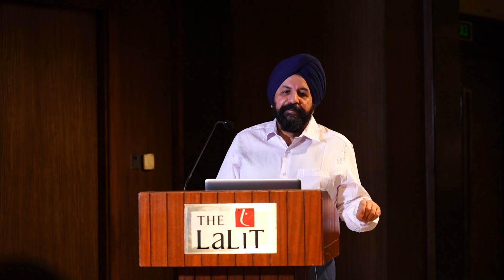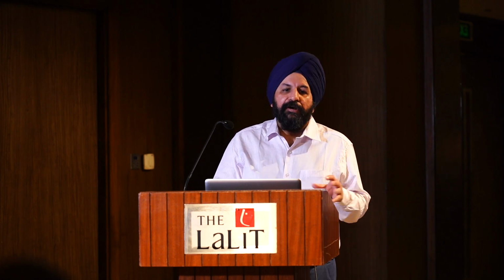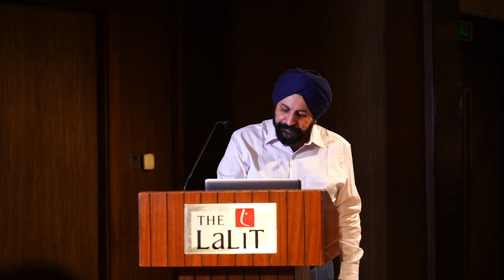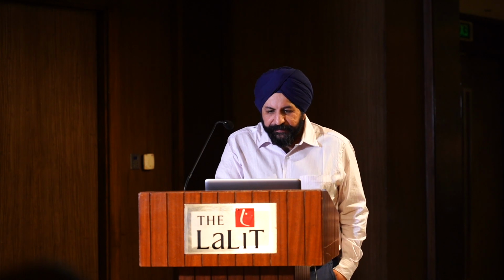Dr. Sen Gupta presented a paper from Calcutta where she shows that the normal reference interval of IPF in West Bengal was very different from most studies coming out of Delhi. We were all giving a biological reference interval of 5 to 6%, whereas she gave 14-15%. So this year, first time lucky, we got the first prize in that competition for this paper.